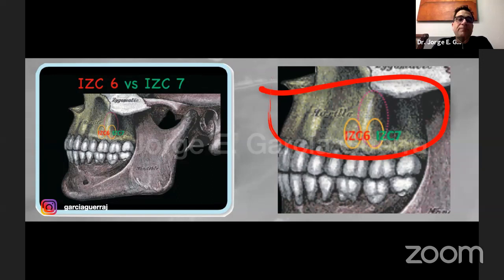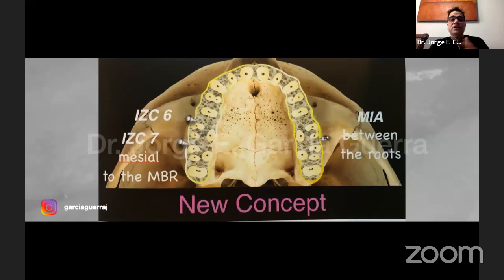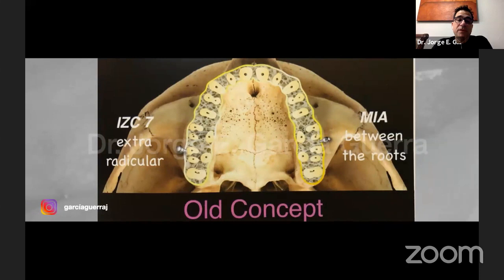Okay, so you can use this outside of the roots, because when we put them between the roots, it's going to be a smaller size mini screw, and we're going to have more failure of the positioning. When you put them outside of the roots, it's going to be easier to do anterior posterior retractions. Okay, that's the new concept that he uses.